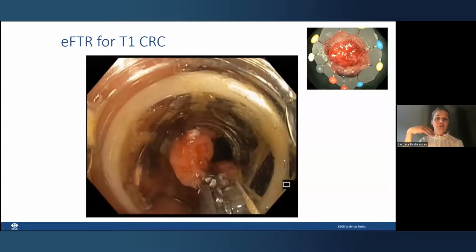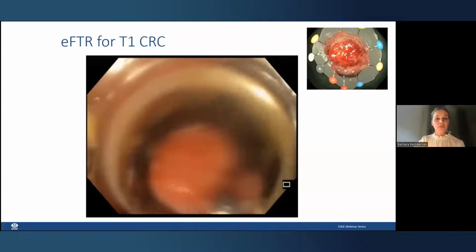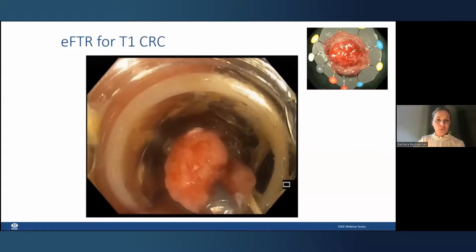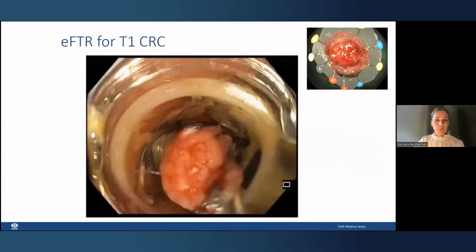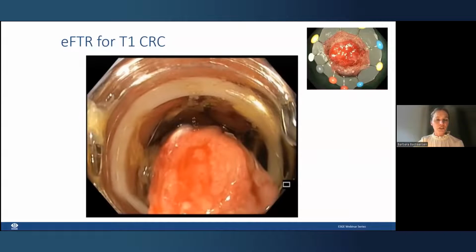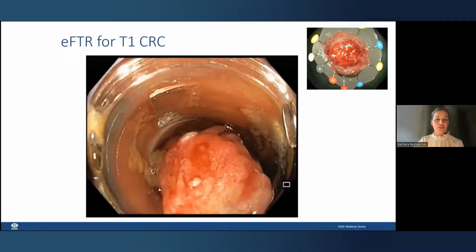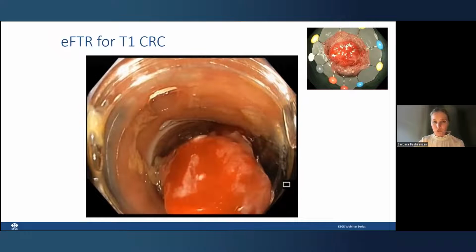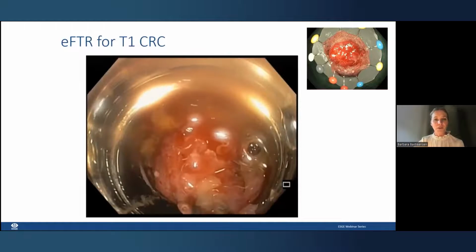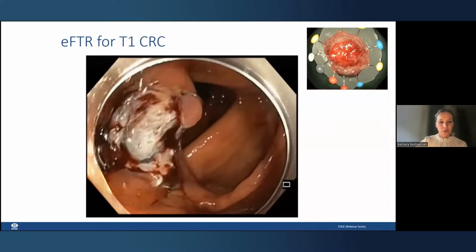And once your cap is being filled with tissue, you can apply some additional suction. You see nicely all markings are coming into the cap. There are also the lateral margin, some additional suction, and now the clip is ready to be released. By turning the hand wheel again, the wide ring is being pushed forward, tissue resection, go back, and then a third introduction will follow again.